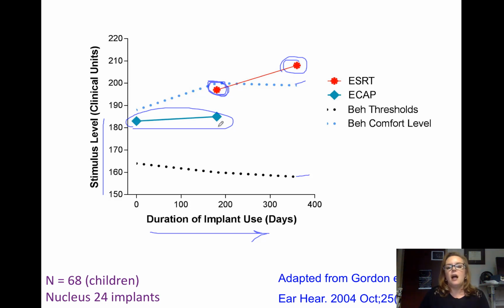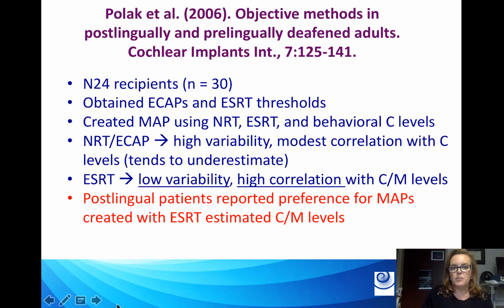Great. But here's the flip side. If you don't see ECAPs, it doesn't necessarily mean that that person won't get auditory percepts with that cochlear implant. So we'll talk about that a little bit more as we go forward.